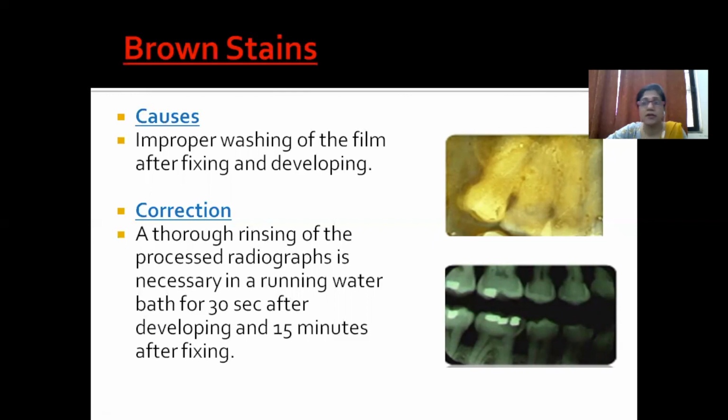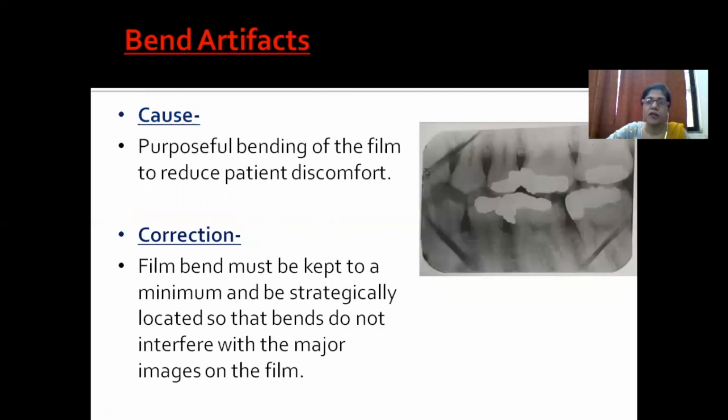15 minutes, I'm saying, it is very important to wash out all the solutions so that your radiograph should not have any of these chemicals sticking on the film. If it is there, it will cause a reaction and you may have these types of stains develop on the radiograph.